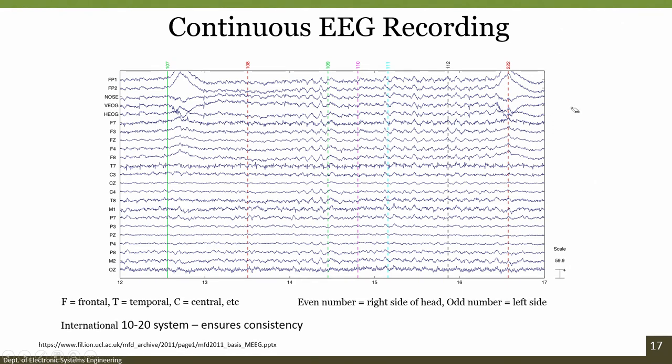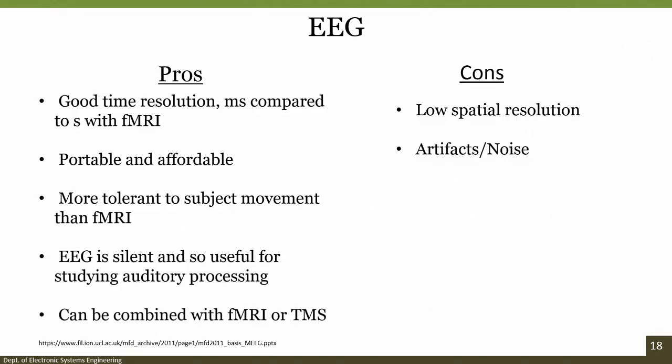It's not so easy to understand just by looking at the signals, but if a person is suffering from epilepsy, then you will see a certain change in the pattern compared to a normal person. So, there is scope for further optimizing the signals and adding a machine learning part to make it easier for a doctor to diagnose.